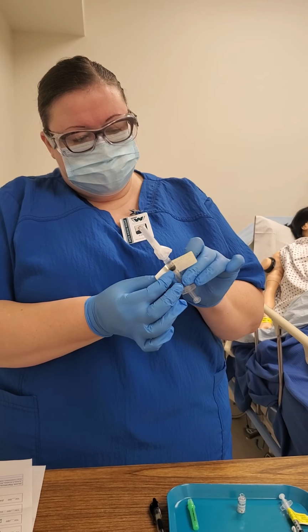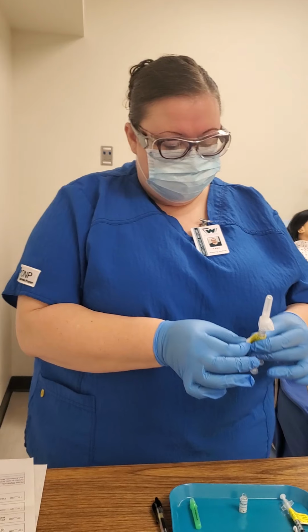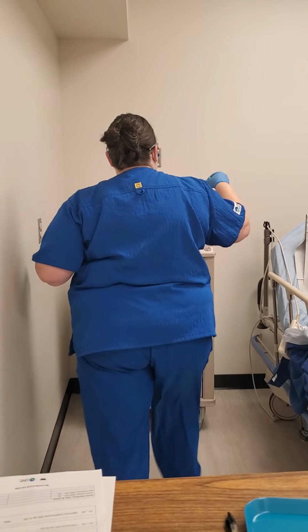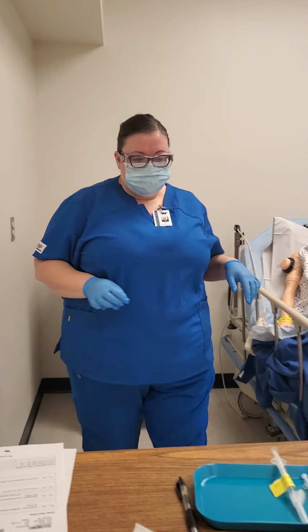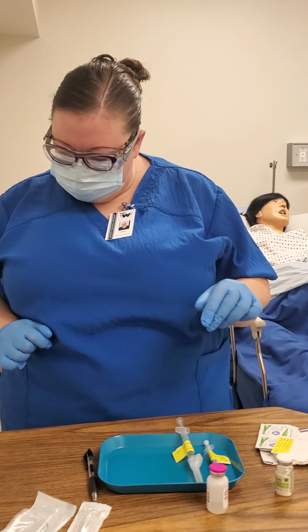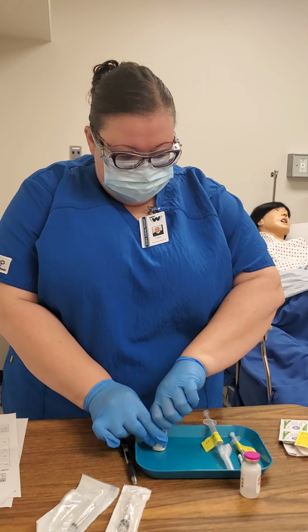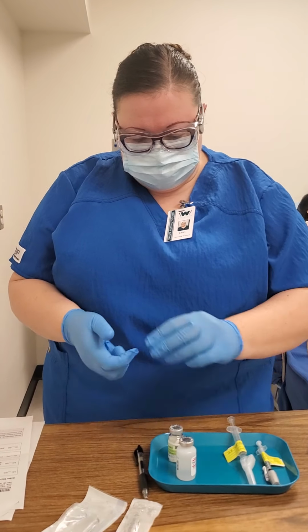And then I have my initials, date, and time on my sticker. Okay, and then I'm going to put this stuff in the sharps container. Okay, and then the third one I'm going to be doing is the ceftriaxone. So I'm going to take my 2 bottles of that. I'm going to sanitize them.